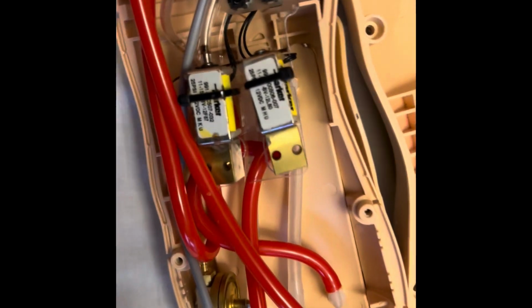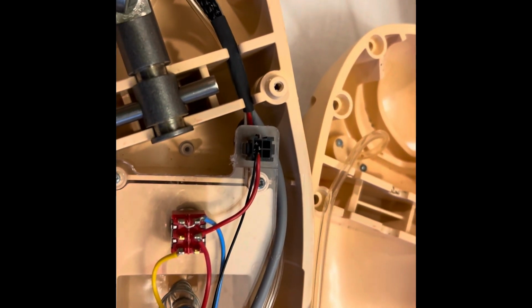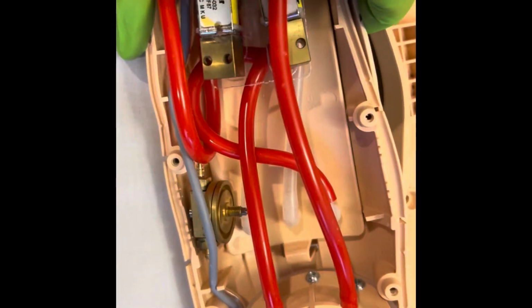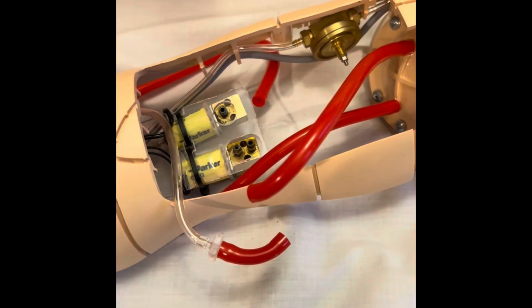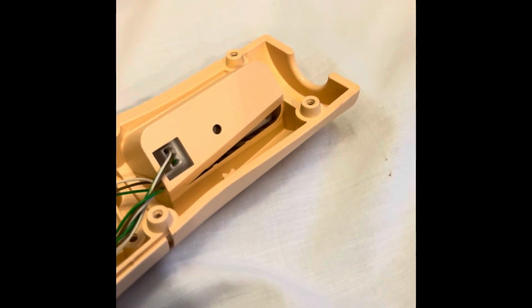Next thing we're going to do is take apart some of the hoses in here. My hose up top here, the clip had broken off, so I'm just going to pull that right out. It was already broken, so I was already going to replace this tip here. It's like a luer lock style that starts the hose out. And then come down to the lower part, flip it over, release this. The skin should be off by now. You can just take it off to the side, and then pull the 2 hoses out that connect to the arm here. Doesn't matter which order. And just set this aside. Move back over. Once you get that hose out, put it back over, and you can actually just remove this part here.